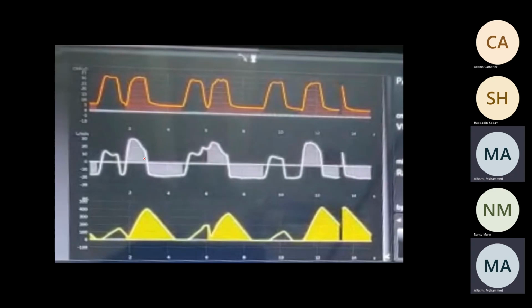How is the resistance going to show you, like prolonged? What do you mean? Can I say this is resistance? You cannot say, because there is a PMUS. It's a very, very smart question, Mahmoud. This is how the curve looks. If I have resistance, maybe it will be like this, and it's not back to normal. How can I know this is because of resistance or because of the PMUS? If I see PMUS at the beginning and PMUS in here, and I know my patient, most probably I will say this is PMUS, not resistance.